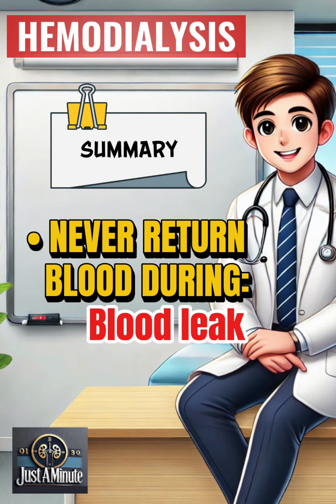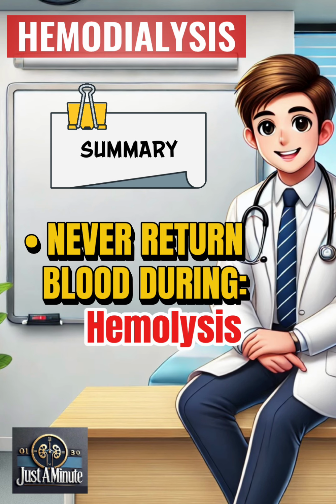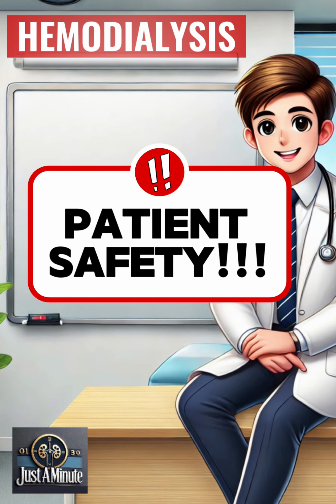To summarize, blood should never be returned during blood leak, anaphylactic dialyzer reaction, or hemolysis. The guiding principle is patient safety. Contaminated or dangerous blood must never be reinfused.